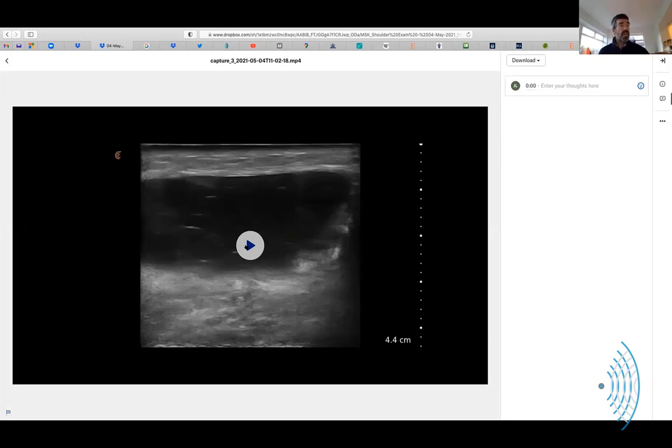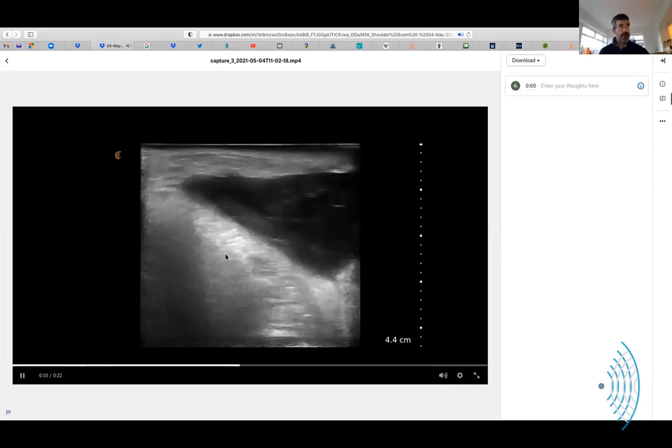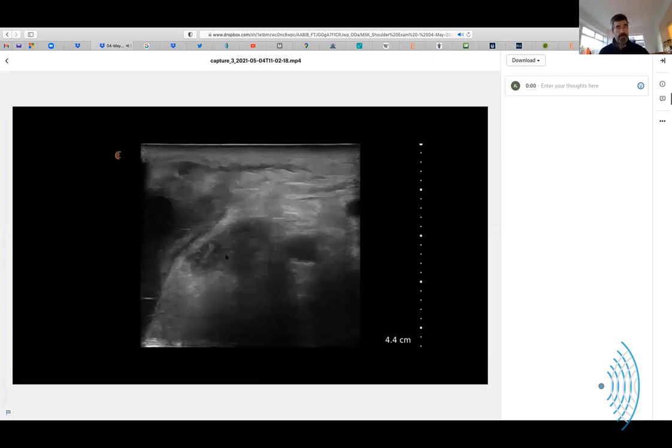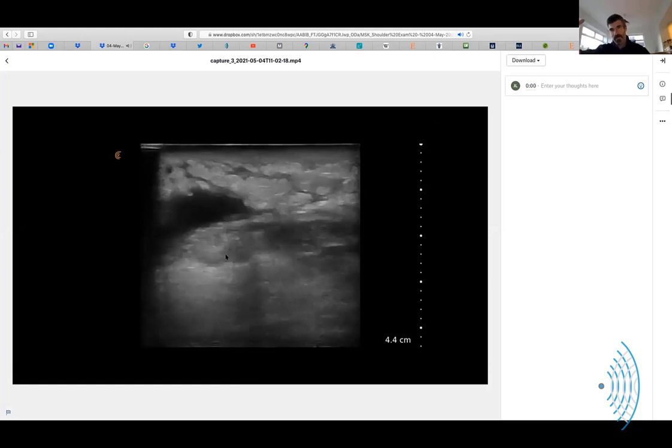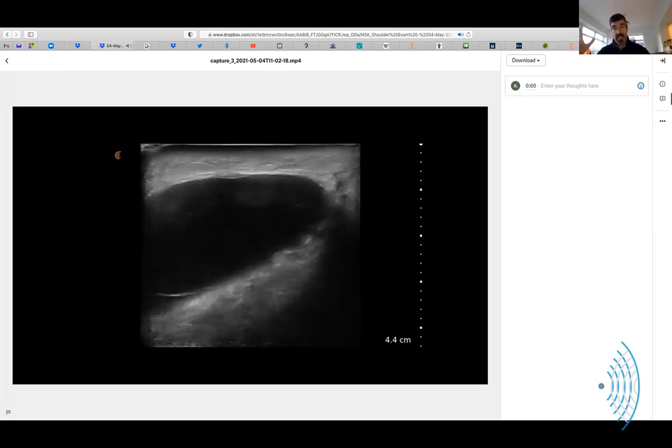But I need help with that, John. I need to remember that, because I like to smash, and I like to smash hard. I forgot what you had said to your students as to how light they should hold this. Yeah, you have to be able to just have a layer of jelly visible over the top of it. Yeah, just superficial. But when you're looking at color, you have to stop the probe essentially. The probe has to be still and there has to be no force.